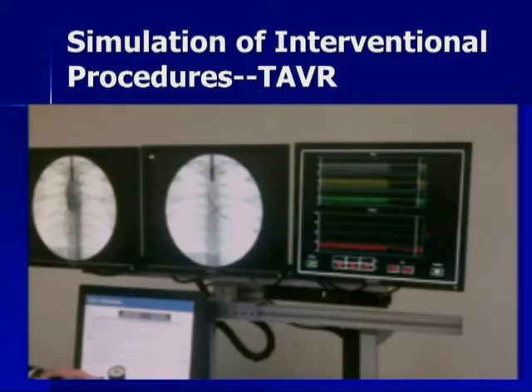So this is actually Joe Cleveland, who's our head of our transplant VAD program, and Dave Fullerton, who's our chief of cardiothoracic surgery. He'll be the STS president next year. But anyways, this is team training. These procedures involve three of us doing this procedure at the same time, each with a coordinated aspect.